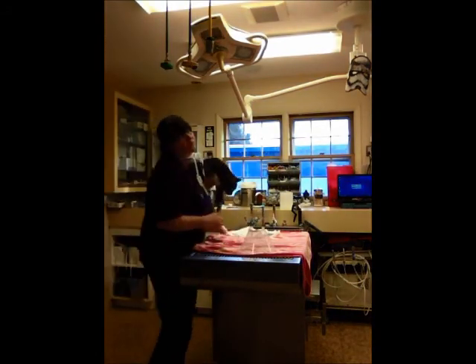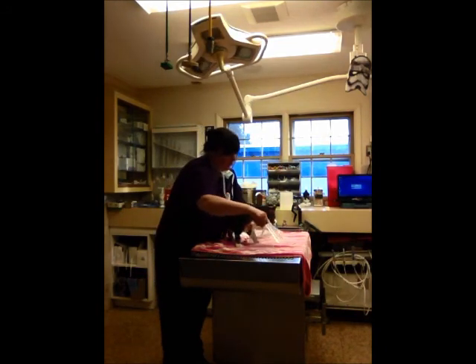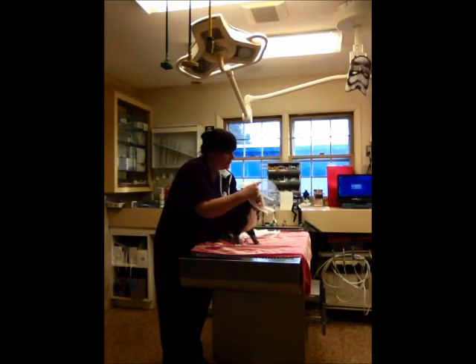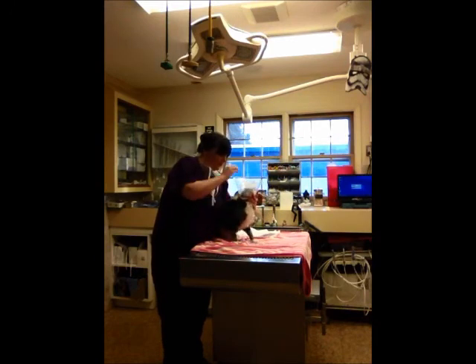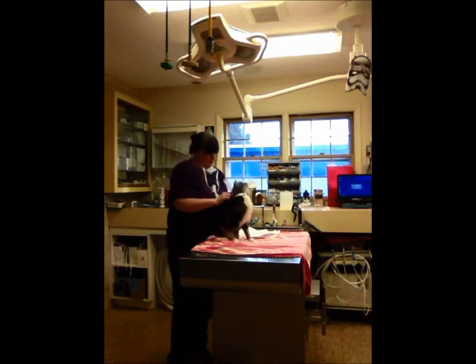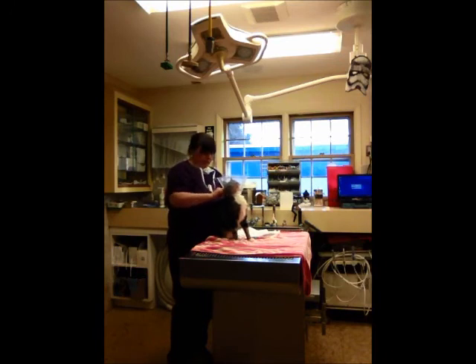Ashley's going to demonstrate how to apply an e-collar, or is going to be my guinea pig. I have the e-collar already made. You're going to slip it over his head, watching his eyes and his ears with little flaps. And then you're going to tie the tie. You can use his collar. You can use a piece of the stretchable gauze. In this case, I just have a piece of medical tape folded in half.